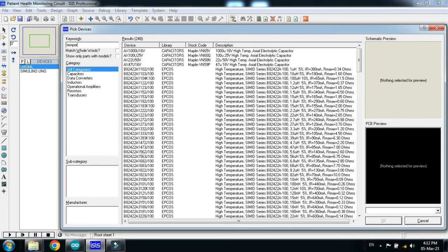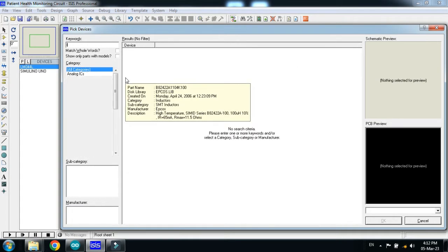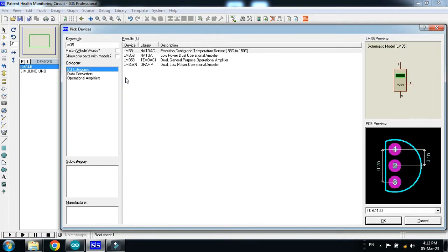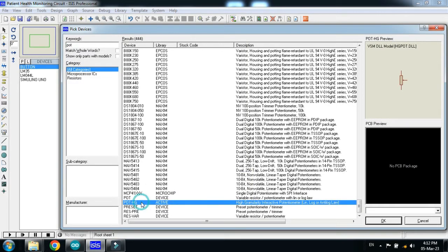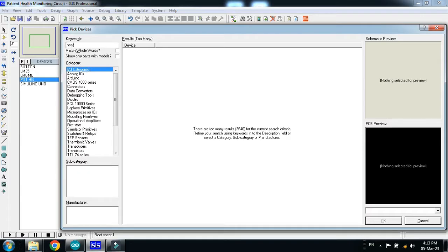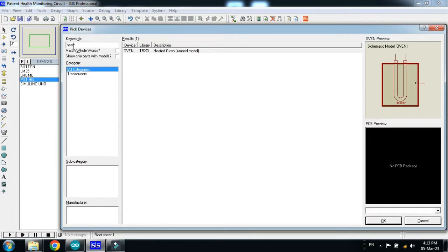Now we will need a temperature sensor — the model is LM35, double click on it. Now we will need a push button, double click on it. Now choose the potentiometer, double click on it. At the end we will need a heartbeat sensor. If you don't have the external library, you will have to add it — I have already added it in the libraries.